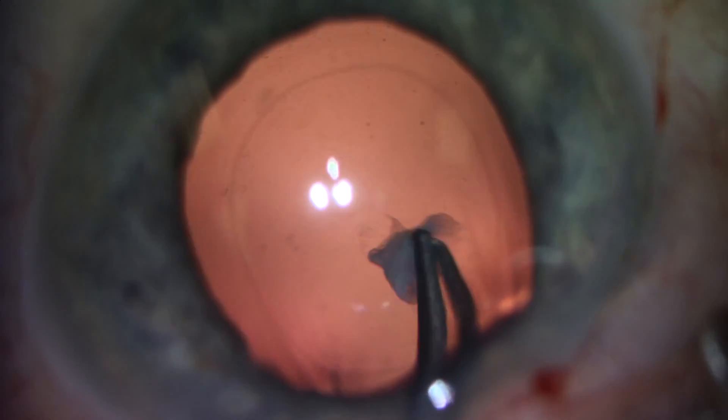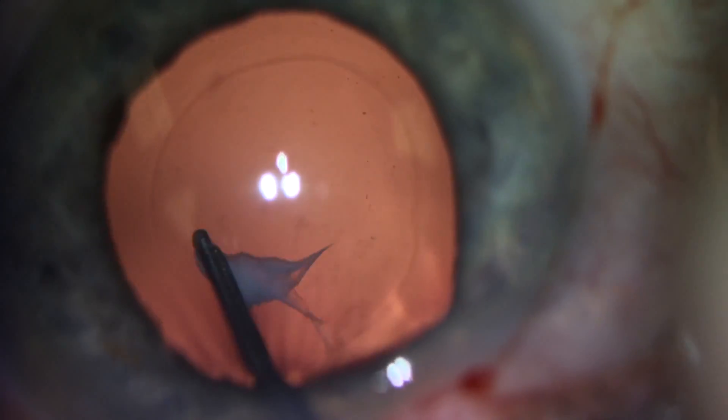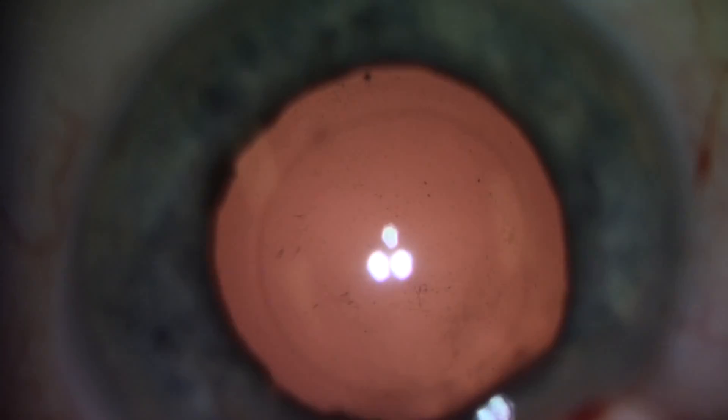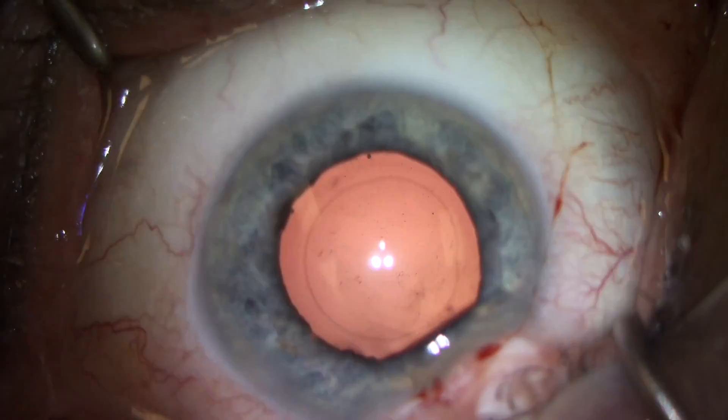In this case, the plaque is able to be removed while leaving the posterior capsule intact. This patient was able to see great immediately and was spared the need for a YAG capsulotomy.